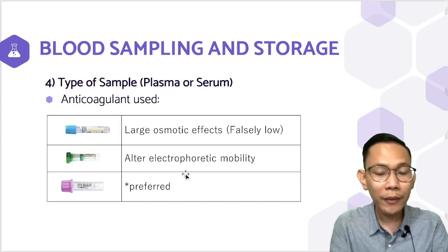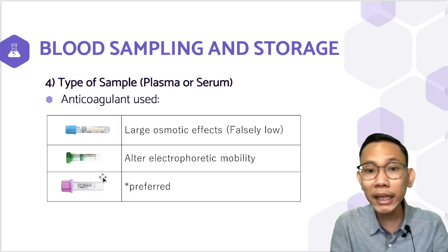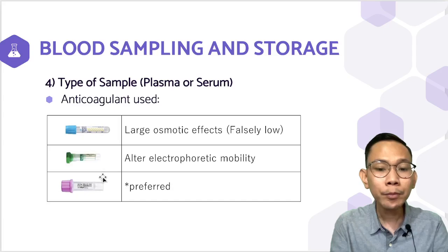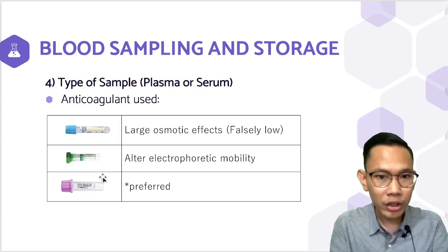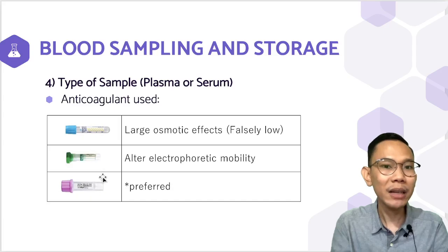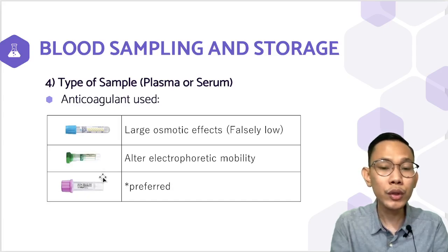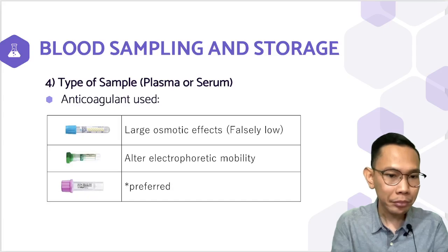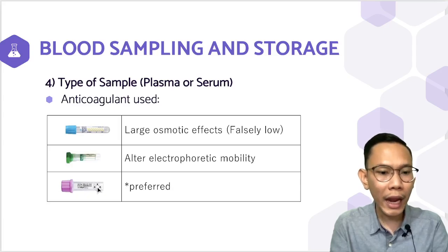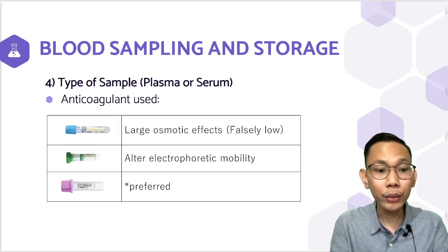So what is preferred is your EDTA because it retards certain kinds of oxidative and enzymatic alterations occurring in your lipoprotein during storage. But always remember that will also depend on the reagents na gagamitin natin. So may mga reagents na magre-require na you will use your plasma, you will use your serum. So magdedepende pa rin yan. But generally, your EDTA will be very beneficial because, again, it retards your oxidative and enzymatic alterations occurring in your lipoprotein.